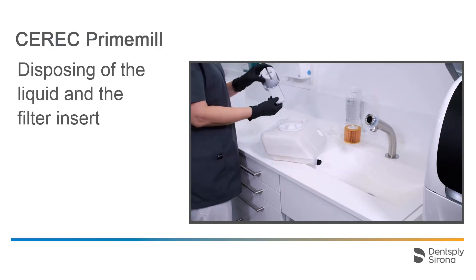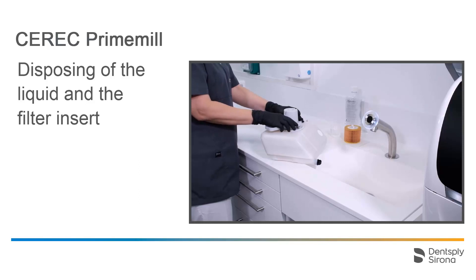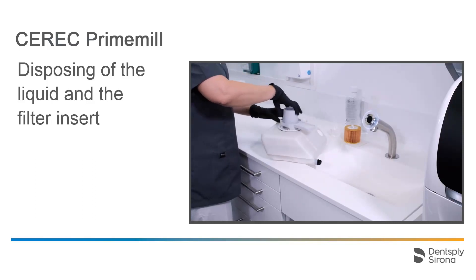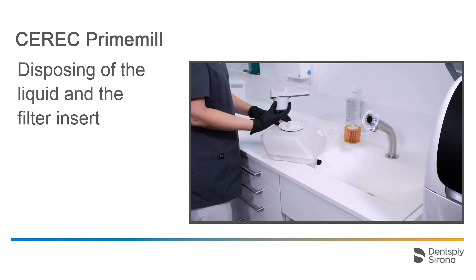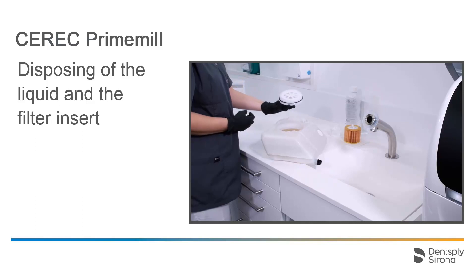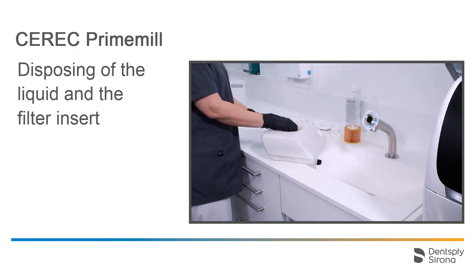First, we remove the tank cap using the tank cap opener. Since we will also change the filter insert, we remove this first and dispose of it.